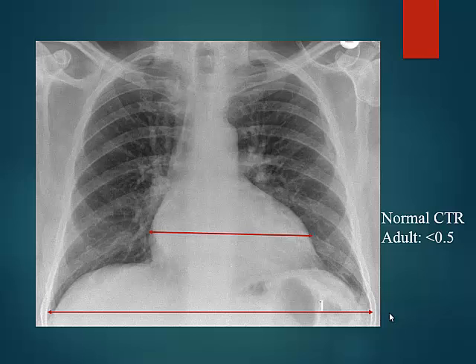So it's a very crude measurement of the heart size. Is it a sensitive way to say if somebody's heart is failing, is dilated? When you say sensitive, do you understand what I mean? Is it sensitive to pick up heart failure? It's not sensitive, okay? You can have an absolutely normal size, but a patient with a poor ventricle. But if it's dilated, then it means something is wrong. So I can say it's specific, but not very sensitive.